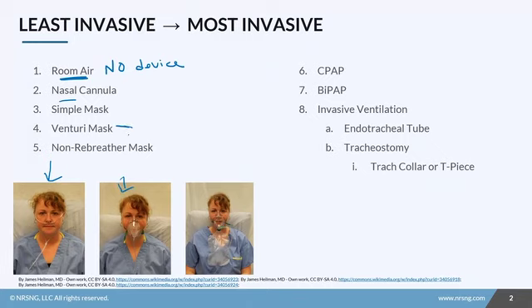And if that's still not working, even though the Venturi gives us a little bit better control, we'll move to a non-rebreather, which is what you see here. Remember, the non-rebreather has the bag attached to it. And then at that point, if your patient's really struggling enough to need a non-rebreather, you need to make sure you call the respiratory therapist, get somebody else involved because this is a significant problem.